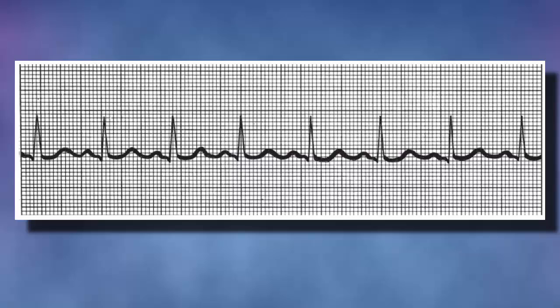Before you get started, if it's hard to tell where the large boxes are, spend a little bit of time figuring out where they are. Now here we go. I've got one box outlined and I can follow the rest from here. Alright, so let's start this process of analysis. Now this strip is showing 6 full cardiac cycles, so we will focus on those.